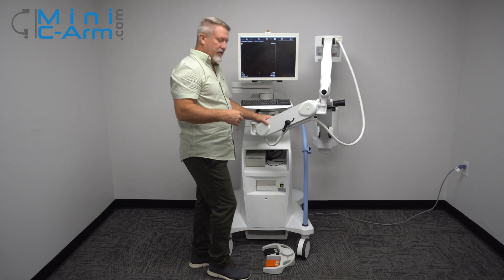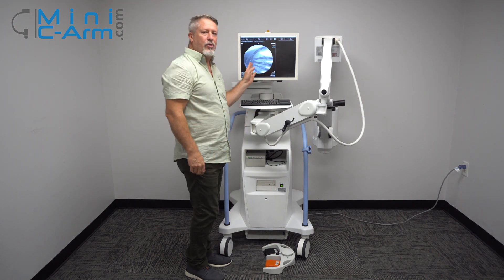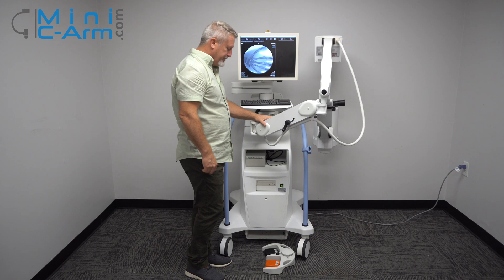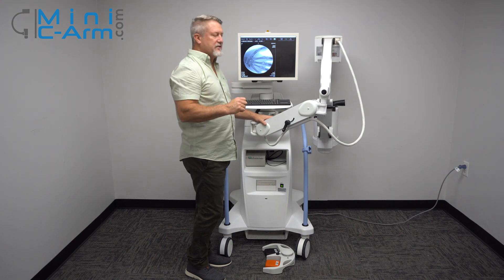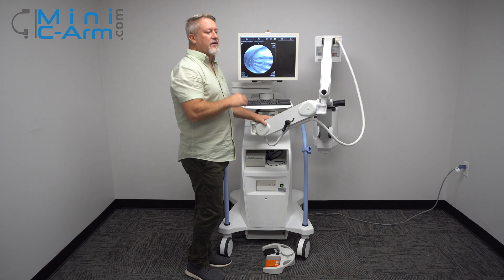While x-raying, hold the button down for at least one second — this will give you the optimal image the machine can produce. Also, wait at least a second between presses so the machine can properly process the images.